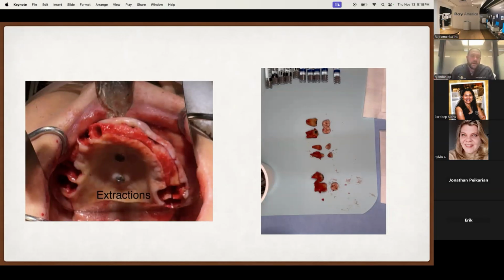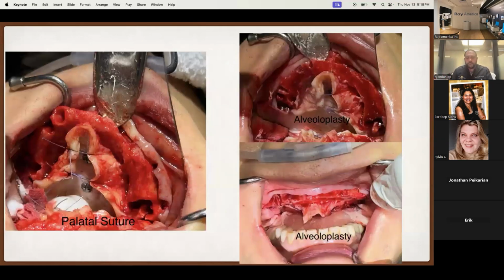Taking the teeth out is pretty simple in a full arch case because there's usually not too many of them left. And usually the ones that are left are either infected or have periodontal disease. So they're usually pretty simple to take out. In this case, I took these roots out in probably about maybe 8 to 10 minutes. But having that buccal flap already open and pushed up really allows me to get the teeth out quicker.